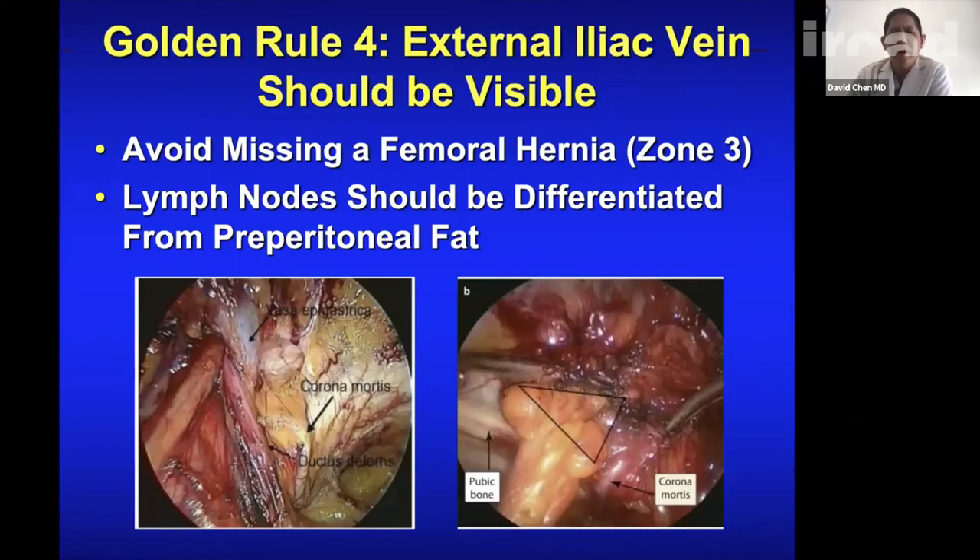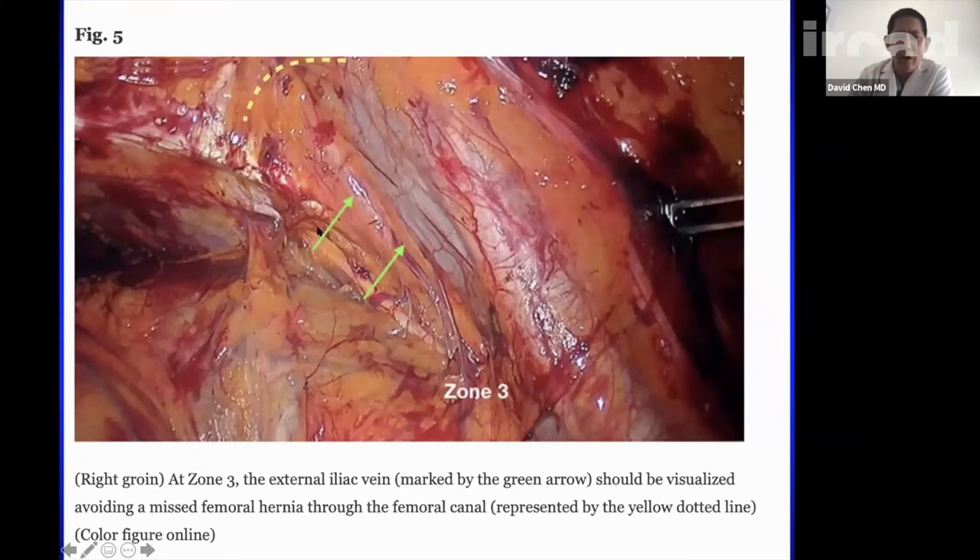Golden rule number four — your external iliac vein should be visible: you need to see it to avoid missing a femoral hernia and to distinguish fat from lymph nodes versus preperitoneal fat herniating. Preperitoneal fat herniating has a broader base like a cord lipoma, while nodal fat is round. You should clearly see your iliac artery, iliac vein, occasionally a corona mortis, your obturator vessels, and have cleared the lacunar ligament. A lobulated Cloquet's node can stay, but fat coming through should be reduced.